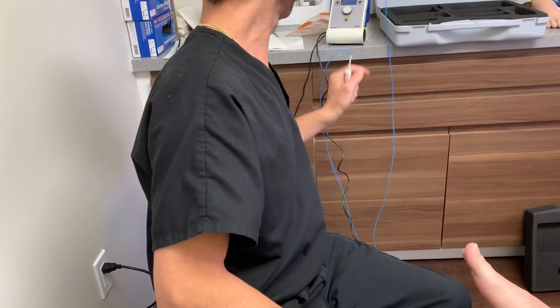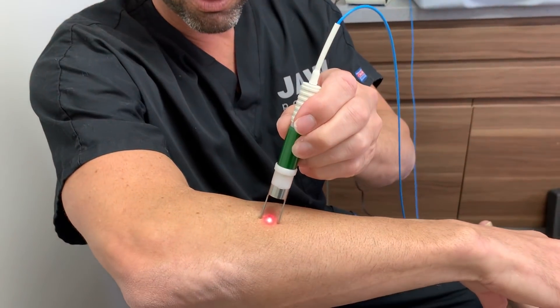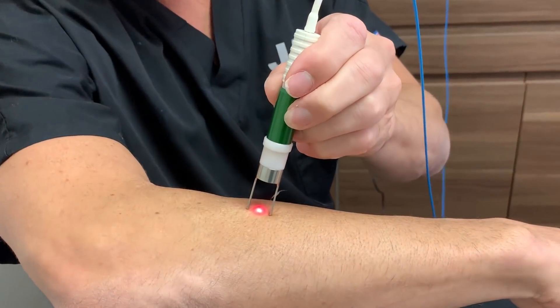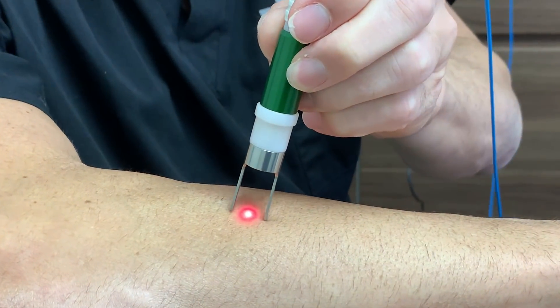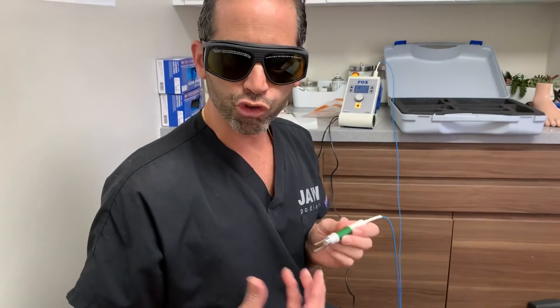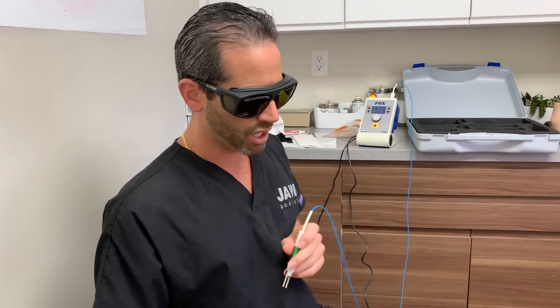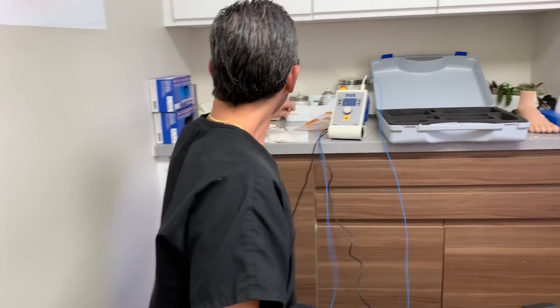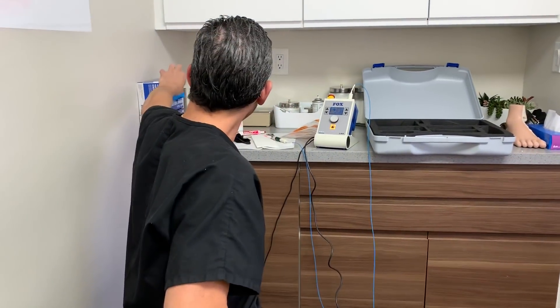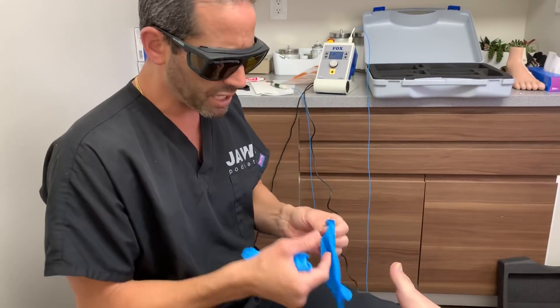Let's go ahead and turn it on. Look very carefully — see if you can get a good picture of this. It is actually burning — it's burning my hairs. The laser has a spectrum; we're not going to get into the physics, but it's really attracted to dark colors. Nonetheless, for this particular patient, I'll just show you one nail.